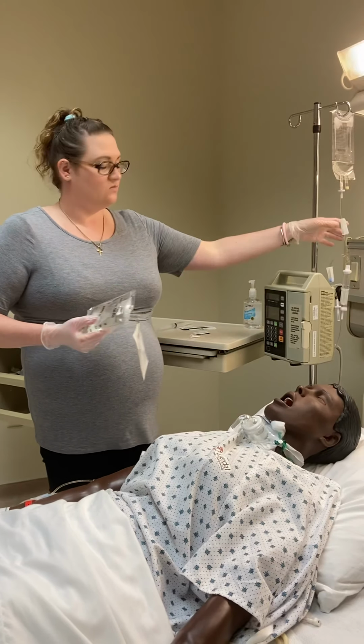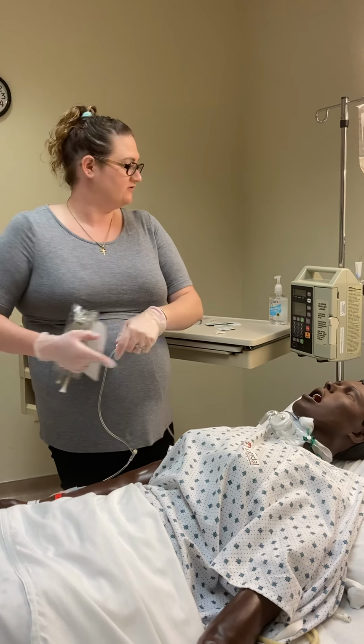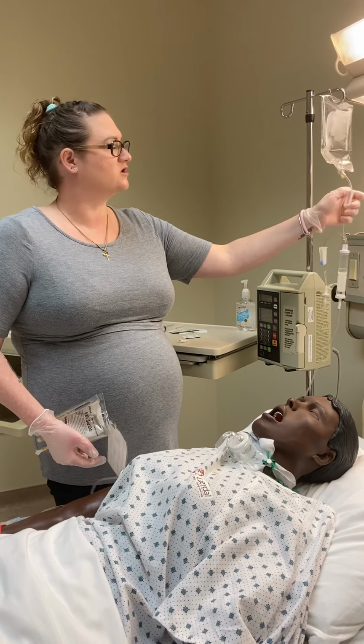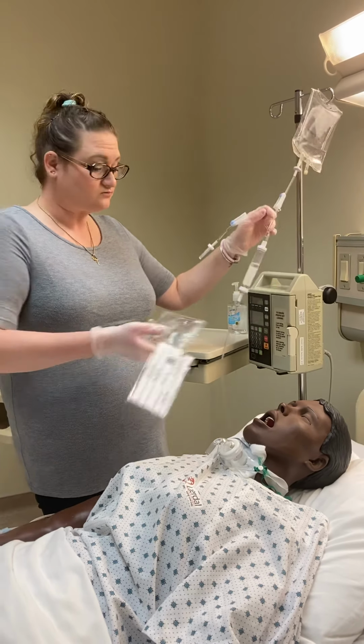So what I'm going to do now is stop my fluids, and I'm going to close my saline lock up here, or my roller clamp. So all of them are closed now.